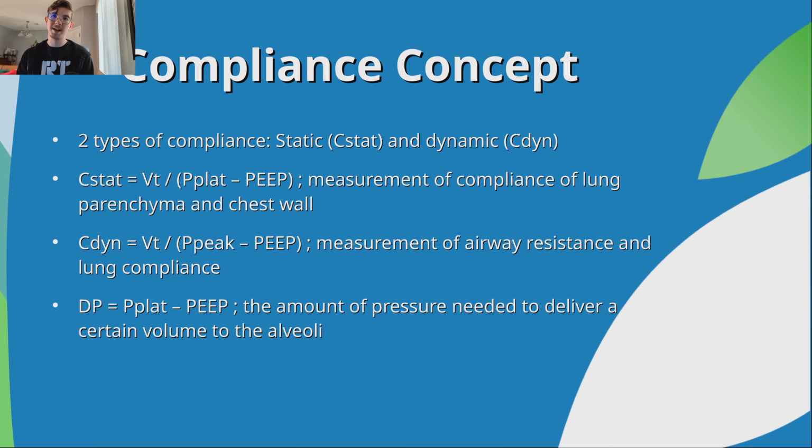We're talking about keeping plateau under 30. We're talking about keeping driving pressure under 15. Peak pressure really is not part of the equation when we're talking about being lung protective or talking about barotrauma. That's going to come up again later as well. Just keep that in mind. When we're talking about compliance, static is really probably the most important one.